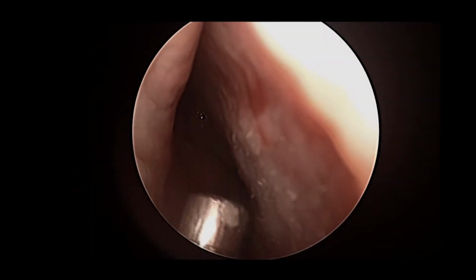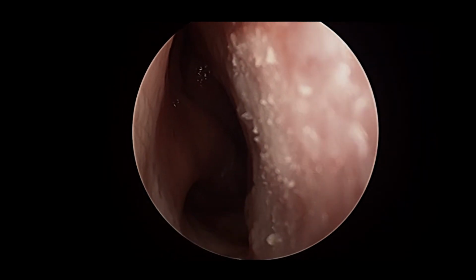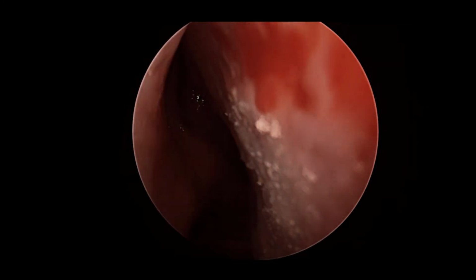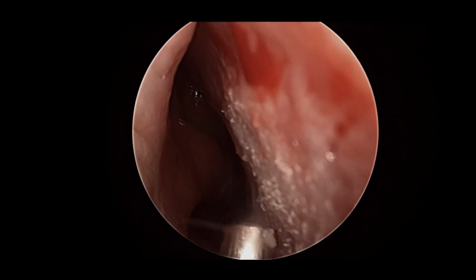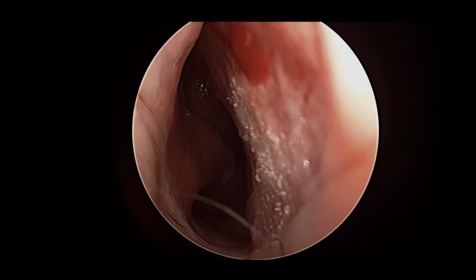crusts. It tends to not have good function in terms of mucociliary clearance, flowing of mucus along its surface, and therefore have crust develop over time. And also the area will tend to be fragile and will tend to ooze blood from the edges, as we're seeing here as we clean the area off.